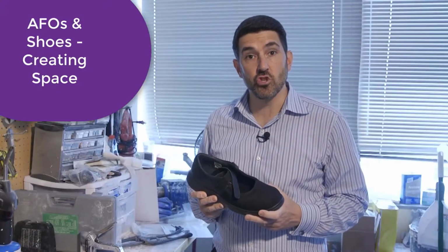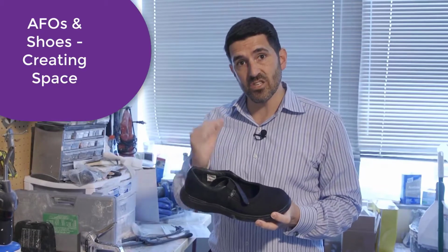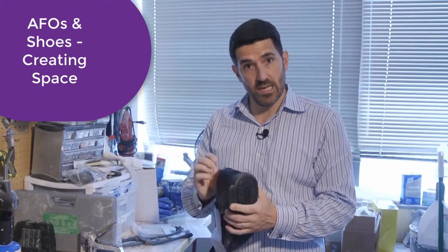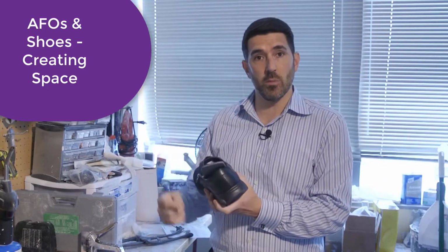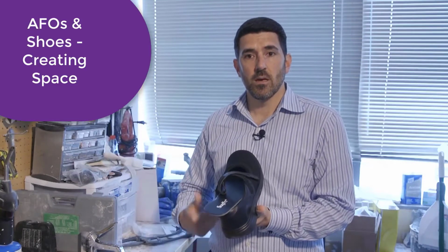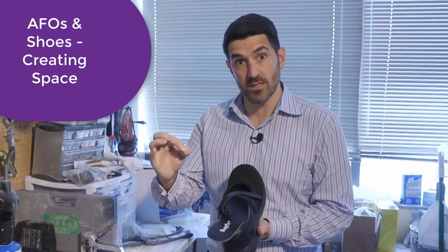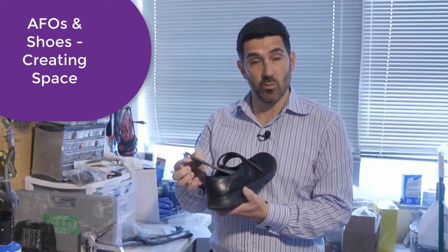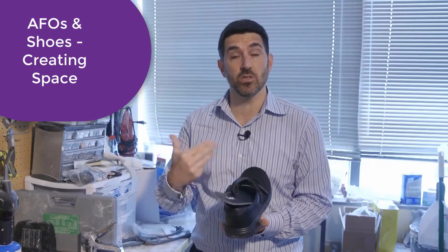We'll say that this is your patient's shoe, and the AFO is not quite fitting so perfectly into the shoe. You have options. One of your options is to make more room, is to take the insole out of the shoe. If we measured that, it'd be about 1/8 of an inch, or 2/16 of an inch. The reason why I'm saying 2/16 of an inch is that an AFO is usually 3/16 of an inch. So we're making a lot more room inside of a shoe if you remove that. You don't always have to do that, okay? But it's just an option for any medical professional, any patient that's watching this video.